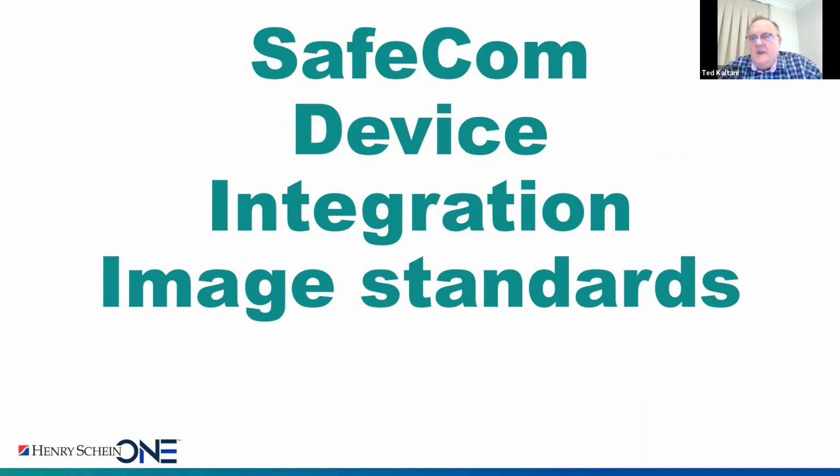Twain is the first imaging standard, built, if I'm not mistaken, in 1994, and it started growing with different versions because the people that actually built it were people from the largest imaging companies, from Philips to Kodak and GE. All the big imaging manufacturers got together in a non-profit organization called Twain.org, and they built that image standard for that very purpose. So instead of customers using proprietary communication with devices, they would use a standard that will allow them to connect to any device with that standard, with a Twain.